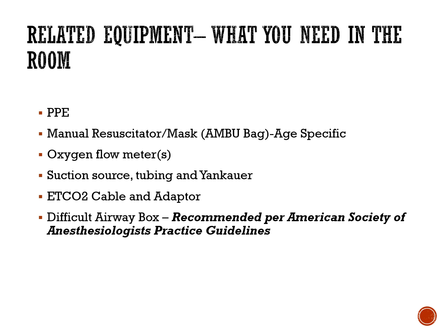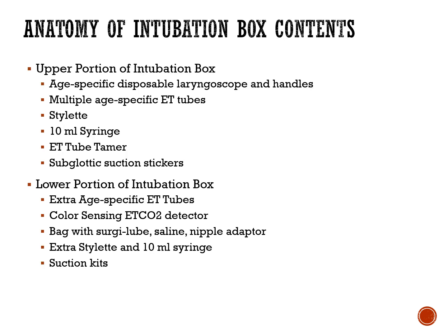And then a theme that I'll be talking about numerous times in this presentation, a difficult airway box. So it's recommended per the American Society of Anesthesiologists practice guidelines to actually have a difficult airway box. And I'll talk about some of the contents that you'd see in a difficult airway box as we get further on in this presentation. Like I said before, and I'm being a little facetious, the anatomy of an intubation box, contents, so basically the contents. And again, there's a little variability from location to location, organization to organization, but pretty much you want the quick access things that you're going to need more commonly in the upper portion.